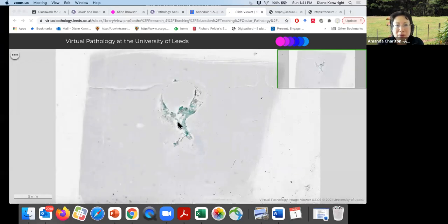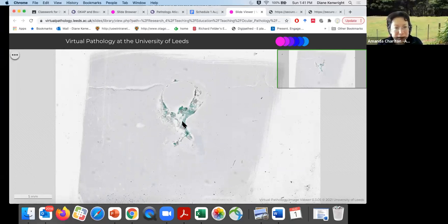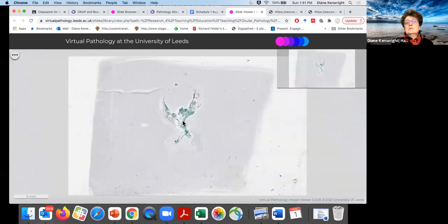Cool. This time we actually do have a special stain to talk about directly, which is pretty cool. So, alrighty. Should we talk through this? It's a pretty small specimen, isn't it? Yeah, I think it's your turn to talk.